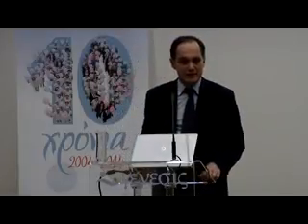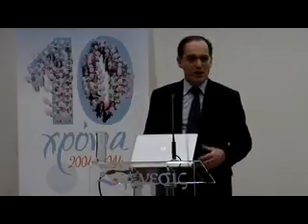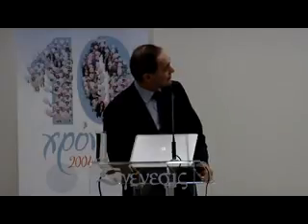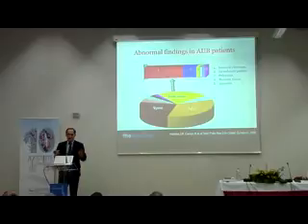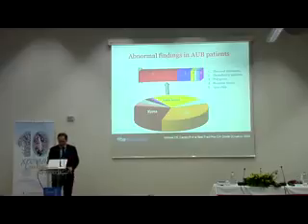If you see 3D ultrasound, and as the director of the clinic showed us, beautiful instruments, beautiful images, a lot of information, but not enough. If you see hysteroscopy, the cervix, the cervical canal, the tubal ostia, beautiful images, but not the total content of information. If you do them together, you have ultrasound 2D, you see myoma and polyps. And the subtle lesion, the precursors, the mucosal elevation. So two totally different groups of population, which reflects the pathology also in those small lesions.